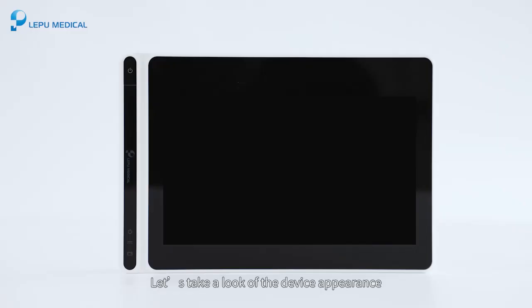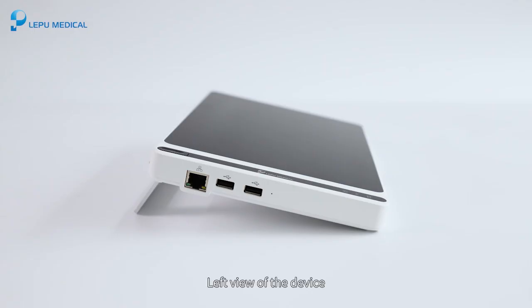Let's take a look at the device appearance. The front view: here is the button for power on/off, power on indicator, DC power indicator, and battery indicator. The left view of the device includes the network connector, USB connector, and microphone.